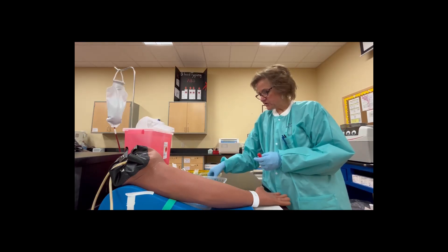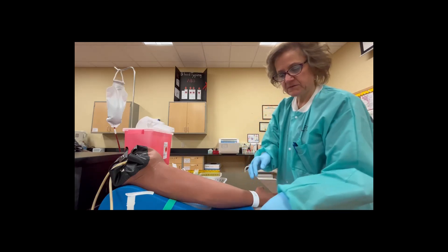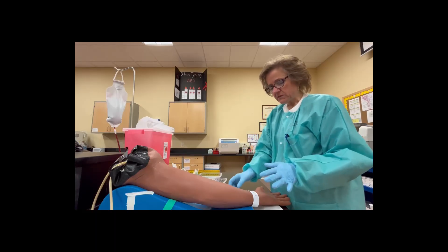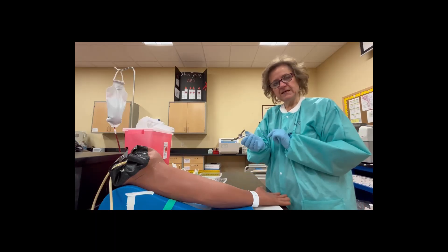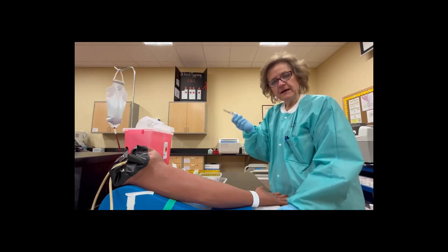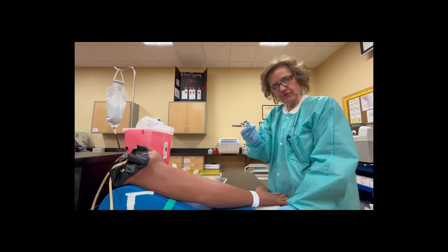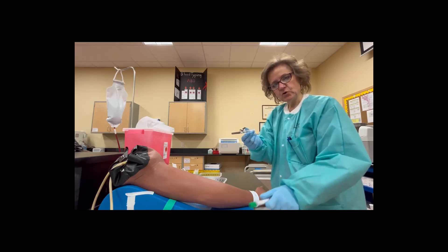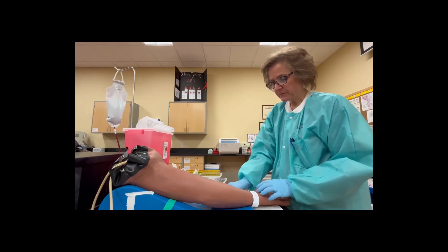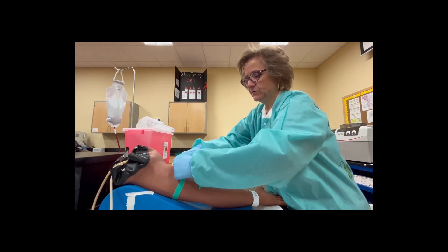While that's finishing drying, after I get the needle put together, I'm going to get my gauze and my tubes and set them to the left of the patient — I'm going to draw two tubes so you can see how I change them. Don't start with the tube in the adapter while you're learning, as it's just one more thing to juggle. I am right-handed, so once I go in with my right hand, the right hand does not leave the holder — I need to be able to get the tubes with my left hand. If you are left-handed, this will be opposite.